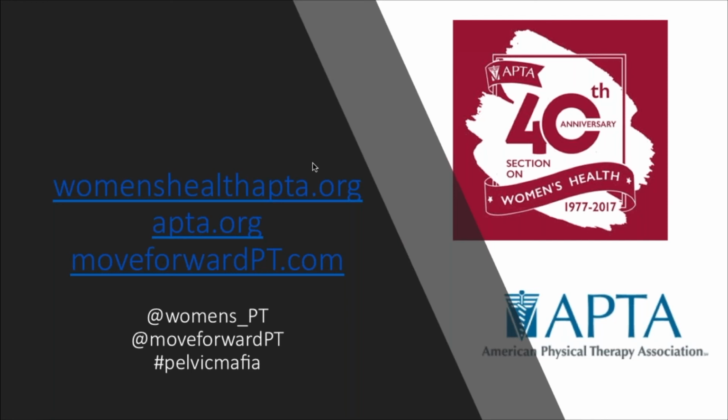Sorry, Adrian, I totally lied. I misread the question. Yes, I actually do that, now that Megan has spoken. Lots of times I will do a quick assessment just to get a sense of what they will automatically be doing, primarily with TA. Sometimes with pelvic floor, but lots of times if they have overactivity of internal obliques, I may get the probe pushed out a little bit, so I may not get a clear reading. So I apologize. The answer is yes.